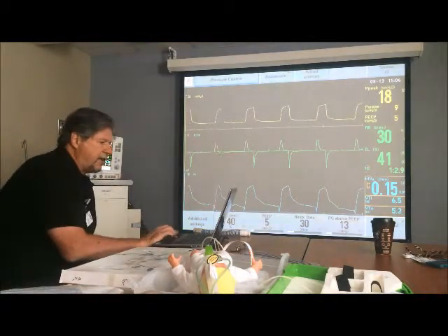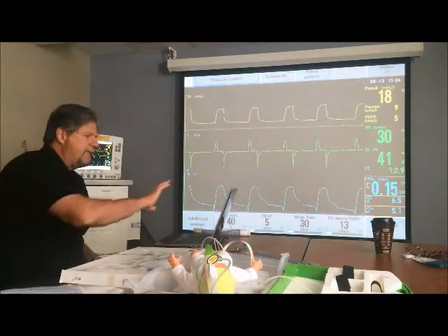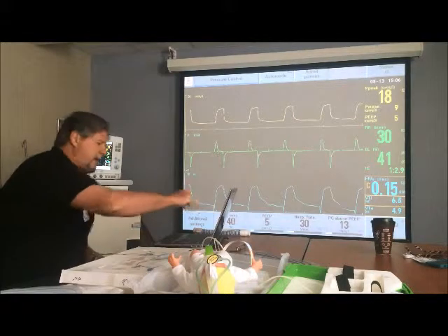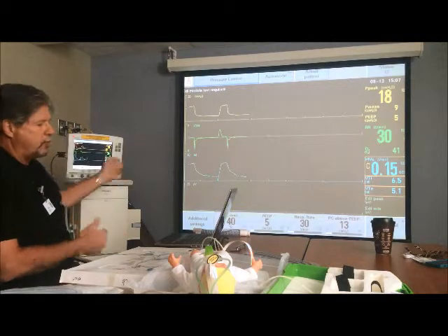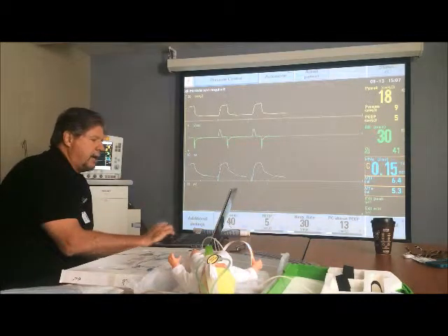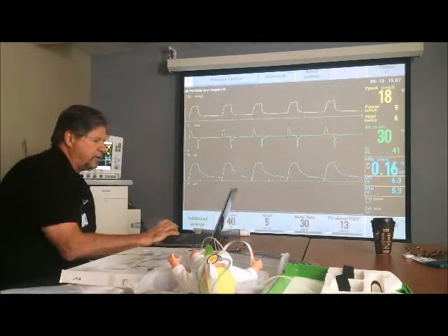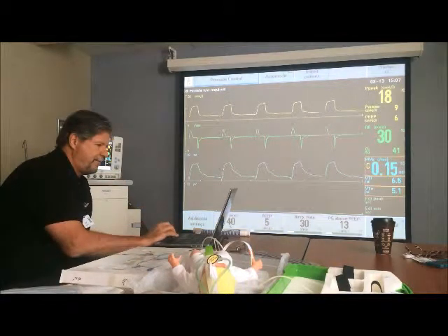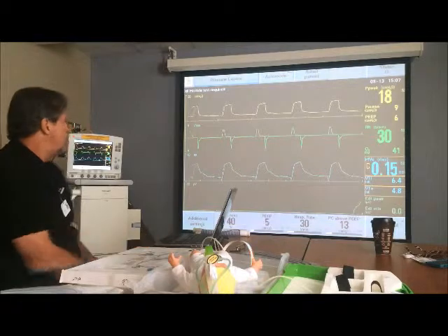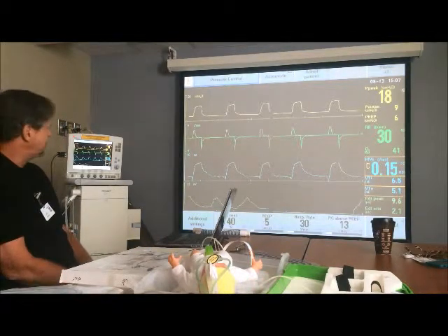But in this case, rather than dropping a catheter in myself to show you what it looks like, we have recordings of patients that are on the ventilator, and I have this cable here hooked into the side of the ventilator, and it's going to be bringing in a patient that was on NAVA. And even though we're talking about babies, I always use this one because I'm so familiar with the way the waveform is going to work. It's a 75-year-old female that had pneumonia that was on NAVA.